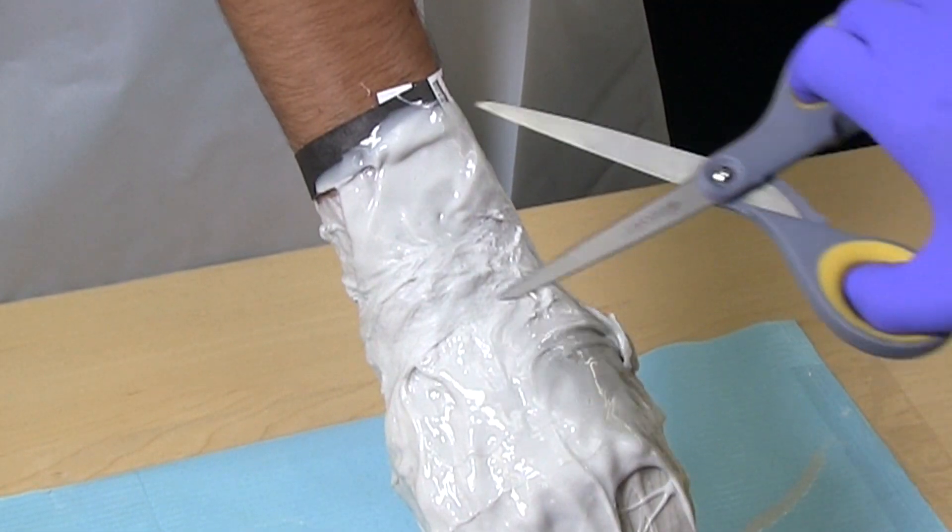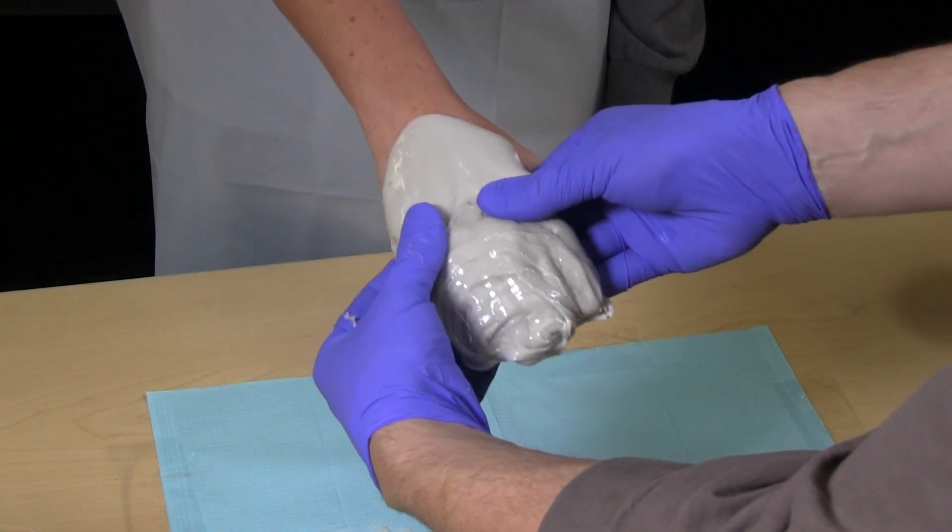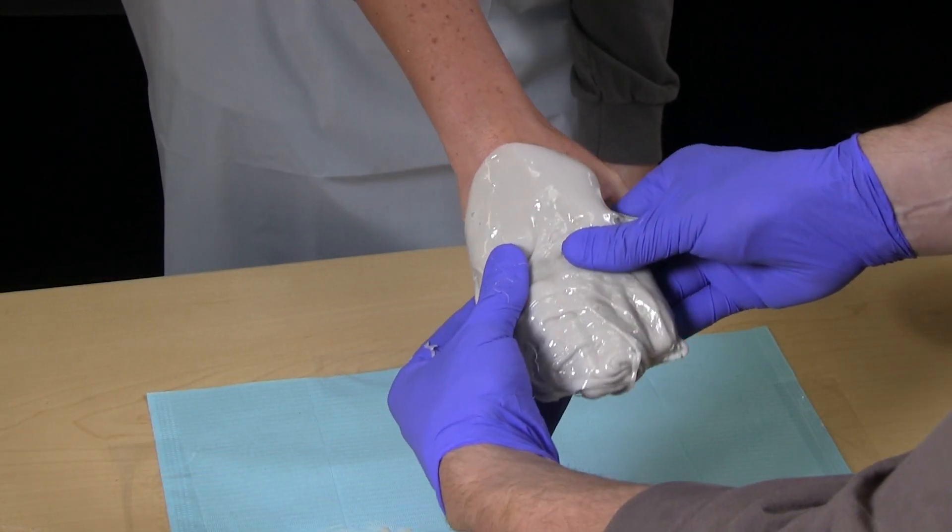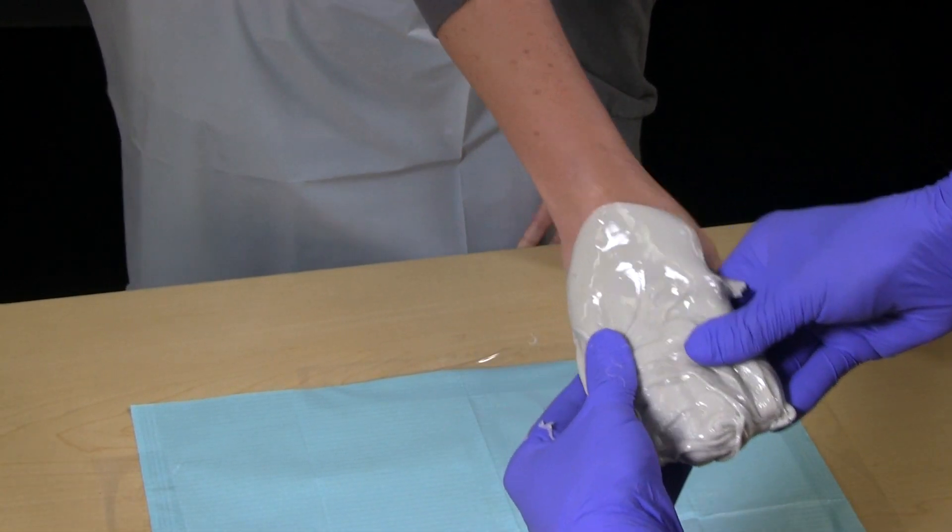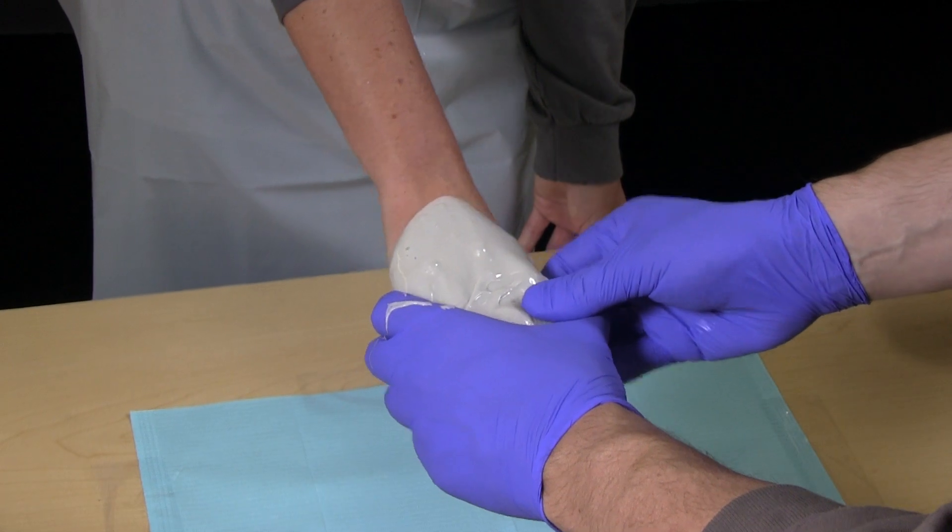Never use scissors or sharp objects to remove the impression. Instruct the customer to wiggle his or her fingers to break the seal of the mold. Remove the impression at a slow pace to avoid ripping out any surface hairs around the wrist.